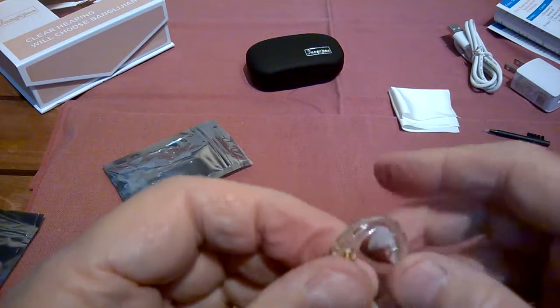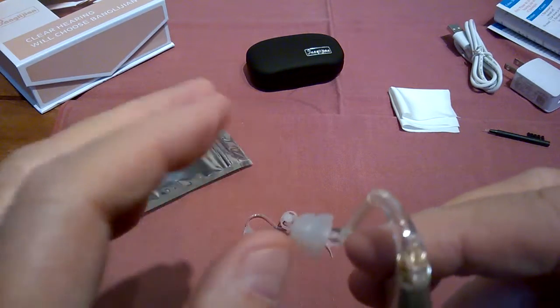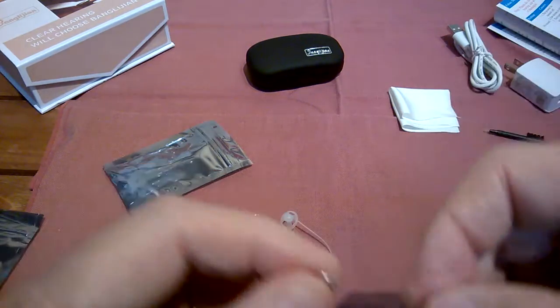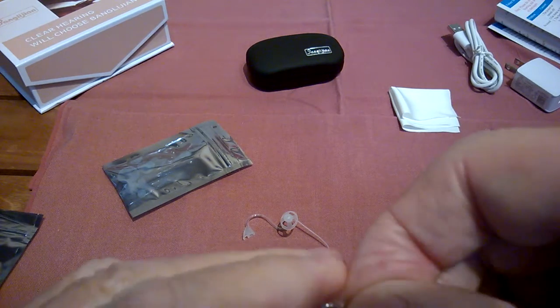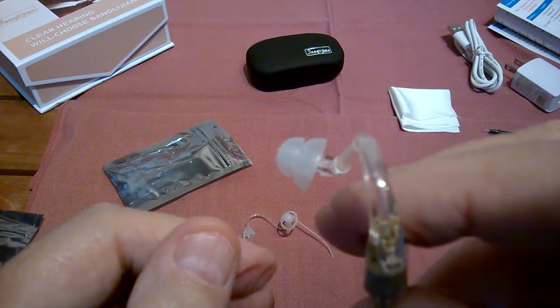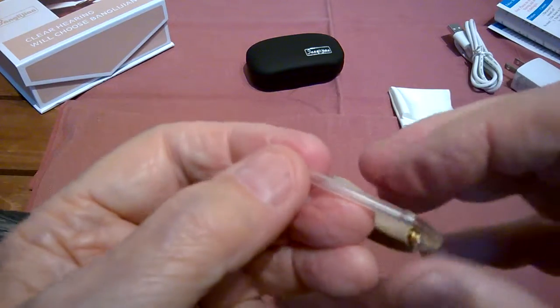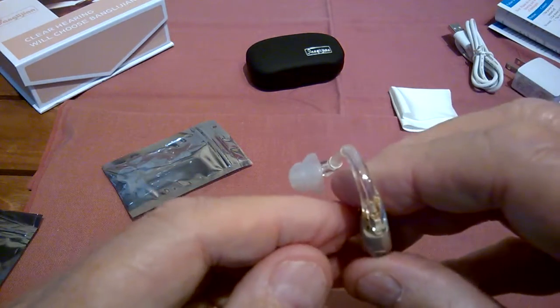Now this will work left or right. And what you do is just turn this to fit. See, this is behind your ear, and this will go to your right ear. If you want it to go to the left, it's easier to undo it, and then aim it towards your left ear, slide it up on the tube again. And now you can use this on your left ear. If you're a little off, it's okay. Just turn it at the top and adjust it to where this will fit where you want it. That's not a problem. It's just easier to start with it near the side you want it.